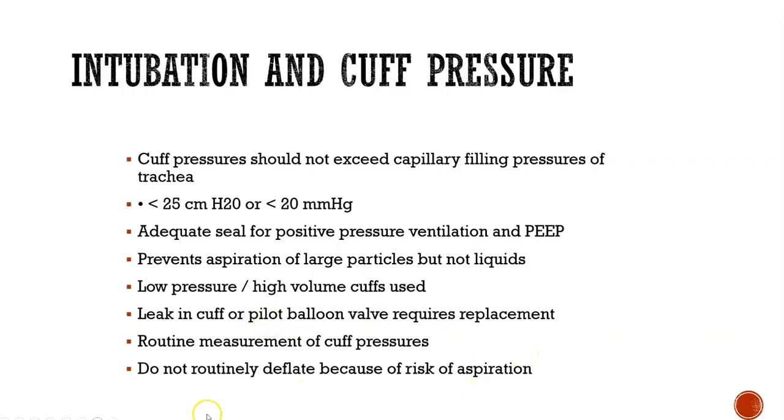Measure your cuff pressures, and don't routinely deflate because of risk of aspiration. If they're cuffed and they need to stay cuffed, there's obviously a reason. Don't deflate it and uncuff it just because. So still really the same concepts as an ET tube.